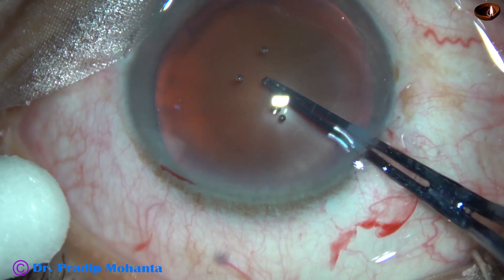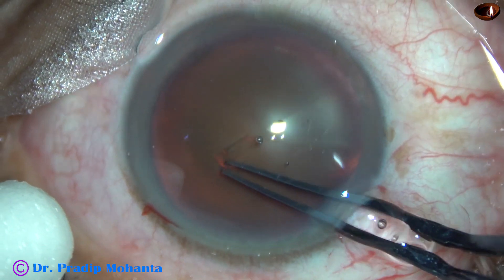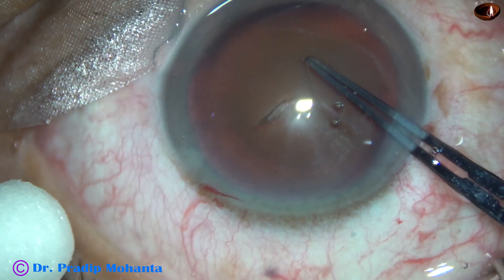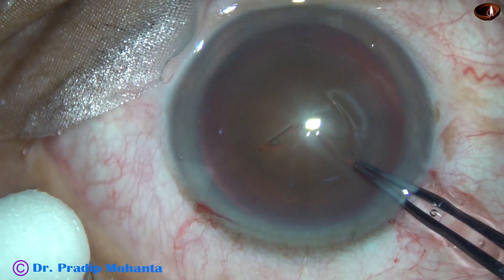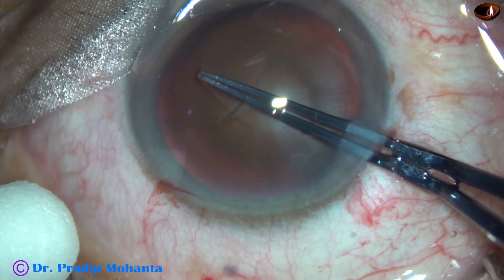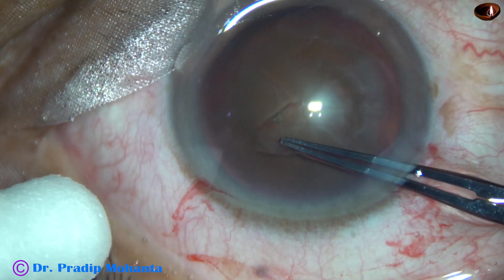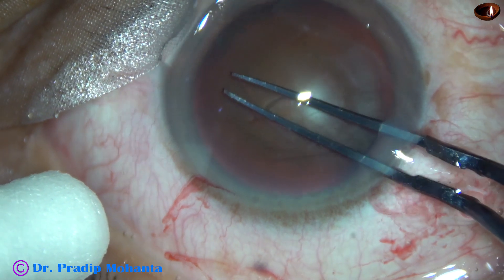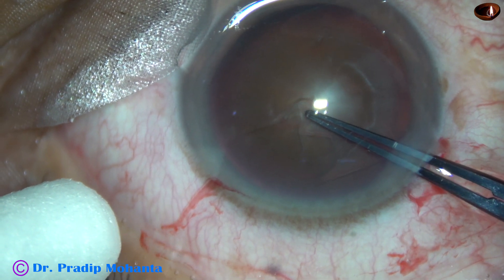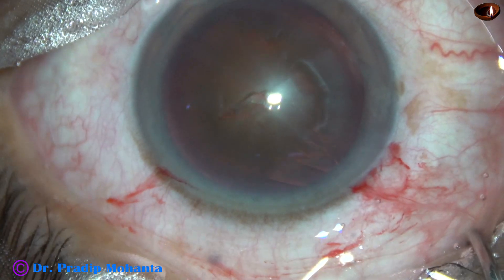Capsulorhexis is done with uteratine forceps, and it is a really large rhexis. The size of this rhexis is going to be about 6.5 mm. When the cataract is very hard, don't bother about overlapping of the optic with the rim of the anterior capsule — just make a large round rhexis of about 6 mm.